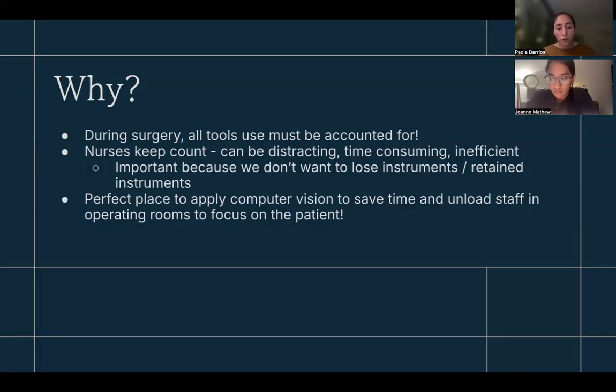And so we figured that this would be the perfect place to apply our computer vision and hopefully build something that can help either track instrument count or just count our instruments for our nurses, so that the staff can focus on what's important during the operation, which is the patient.